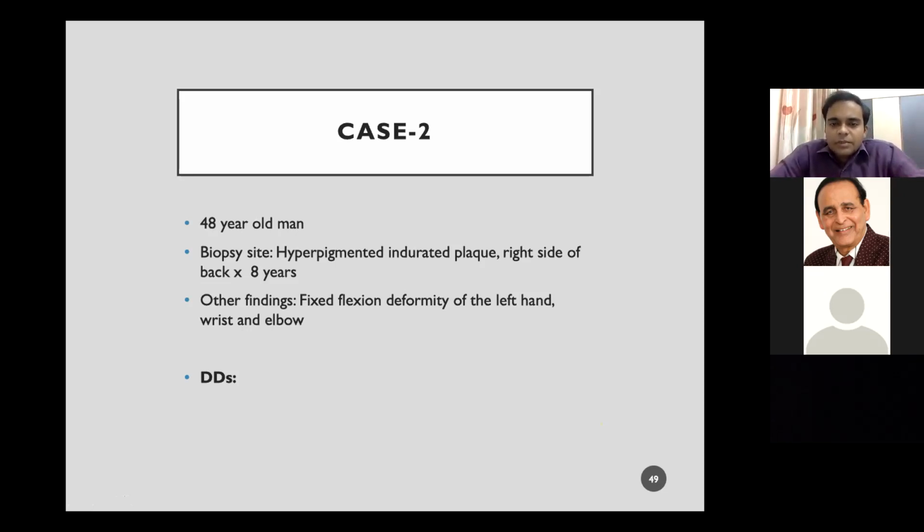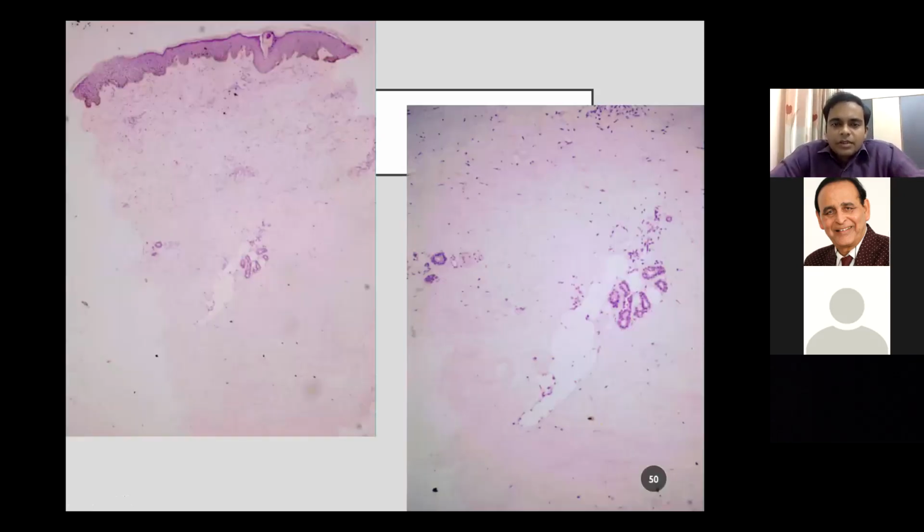But when we looked at the patient in the slide, basically, we looked at the slide and you can see there's nothing to suggest anything. You have a lymphocytic infiltrate in the upper dermis, in the perivascular location, and interstitium in between collagen bundles. And then you have just plain dermal collagen, just bland collagen.